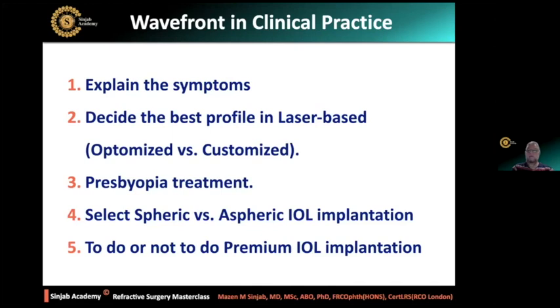In addition, wavefront is used in presbyopia treatment when we do the laser-based presbyopia treatment, because some profiles or some methods change the asphericity of the cornea. Now, the higher order aberrations, I mean, the wavefront, helps us in selecting the monofocal IOL, whether it should be spheric or aspheric.